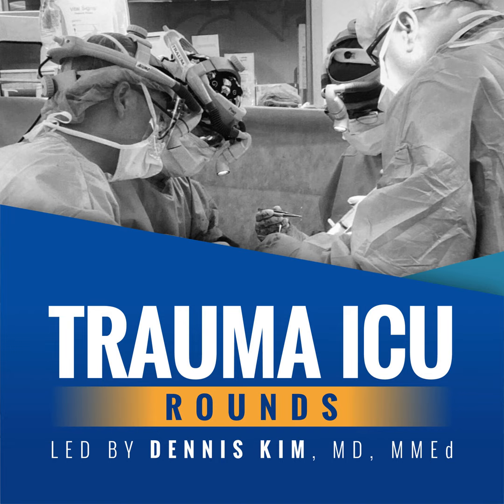Regarding flow rate, which is typically set somewhere on the order of 60 to 80 liters per minute, if this is set too high, this will result in high airway pressures because rapid flow generates more airway resistance. Conversely, if the inspiratory flow rate is set too low, patients will experience air hunger with evidence of respiratory muscle use on the ventilator display, and that's a discussion for another rounds, and clinical evidence of patient ventilator dyssynchrony due to patient demand exceeding the delivery of flow.